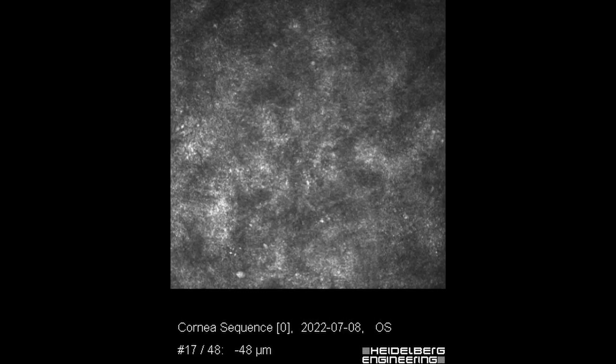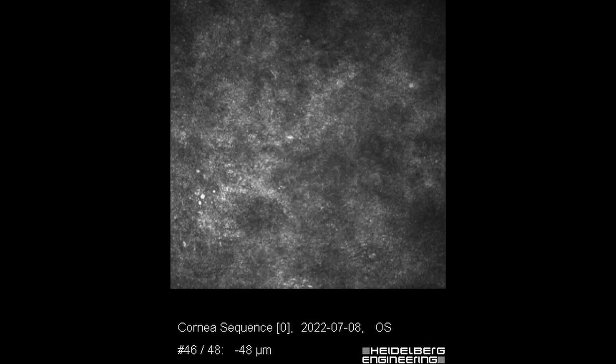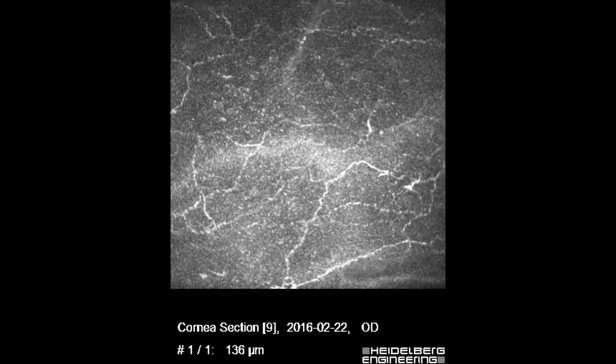The downsides: first, the software was never really upgraded — it would be nice to have a caliper option, which you don't have. To calculate the size of a lesion you need to export images to ImageJ or Photoshop and use the scale bar on the image. Another problem is the cost of operation — sterile caps each cost a couple of euros, and if you want to do both eyes that adds up. Additionally, you can't accurately pinpoint where you are on the cornea; the side camera gives you a rough idea but it's a guess rather than an accurate description.